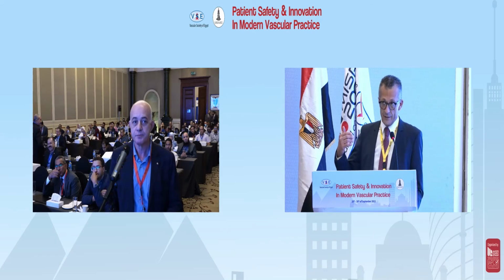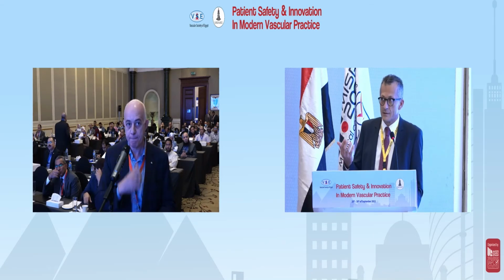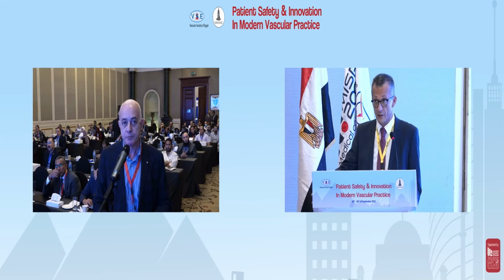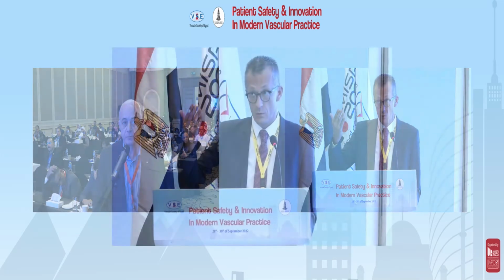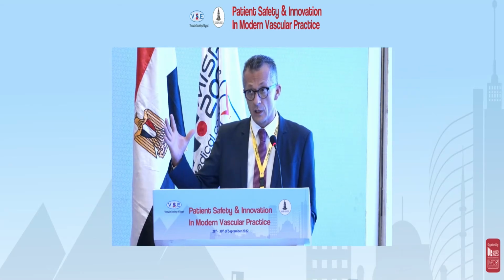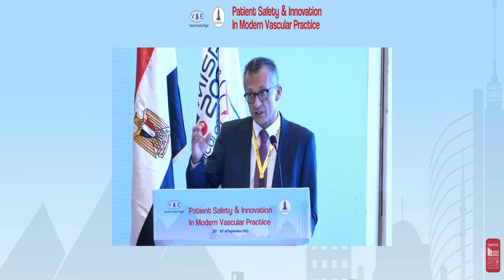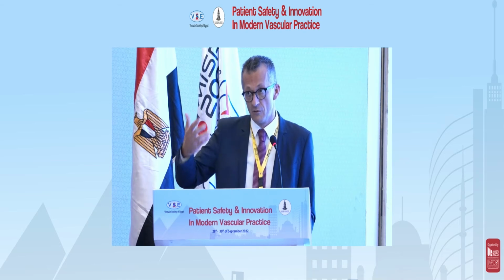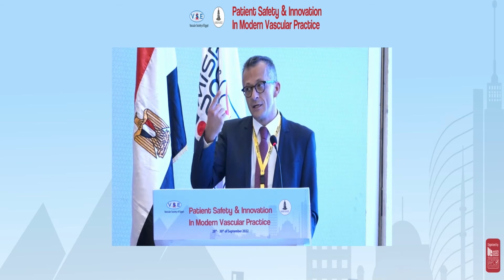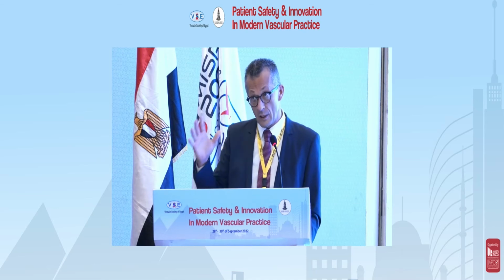When we work in this situation, it's similar to when we work in the venous system. We work without flow. The mandatory thing, using Rotarex, is to work with flow. So when we work in retrograde, we work without flow.